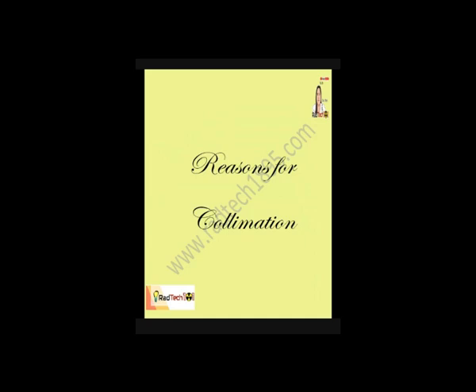Next, reason for collimation. So, when we say collimation, nire-restrict lang natin yung exposure dun mismo sa area of interest. Halimbawa, ito yung structure, basta halimbawa yan yung structure.